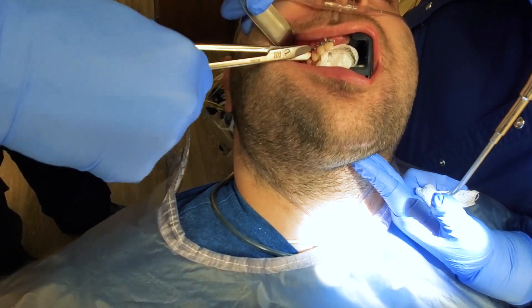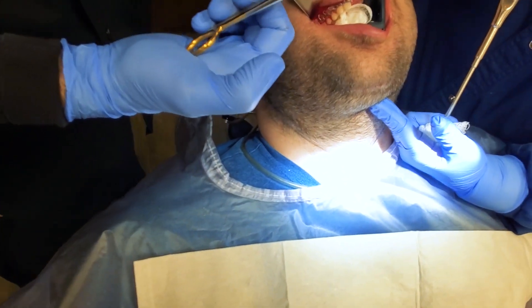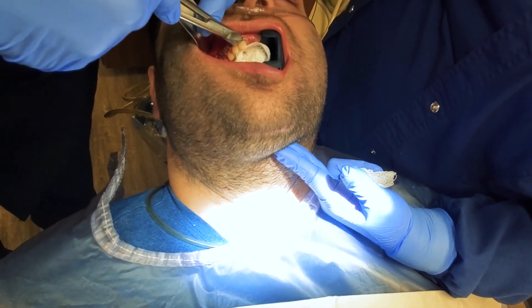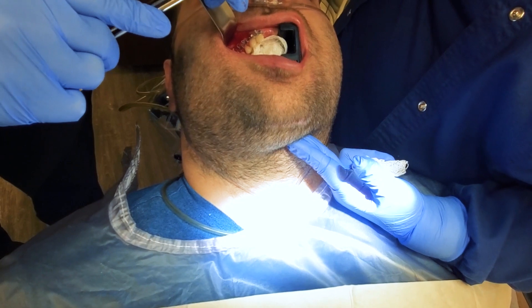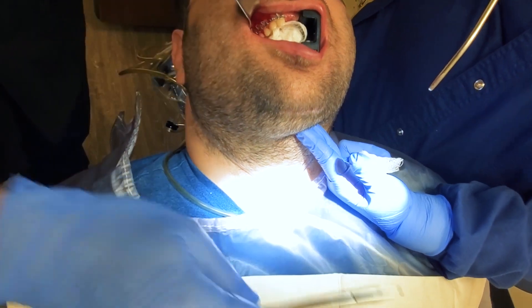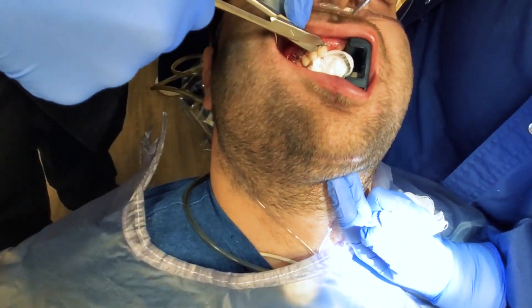These weren't doing it, so we're going to get some different wire cutters because the tip on these things is not functioning properly. See how it doesn't really cut? There's something going on. It's a little green — these are worn out basically. They're not snipping. Get rid of them.